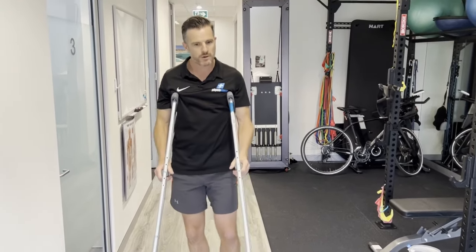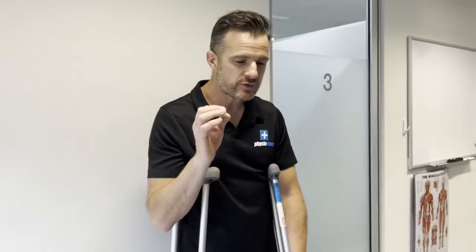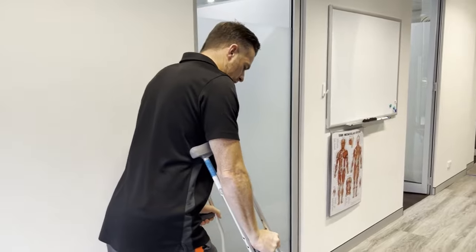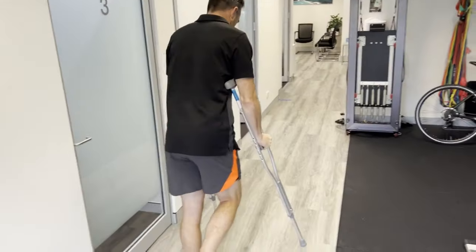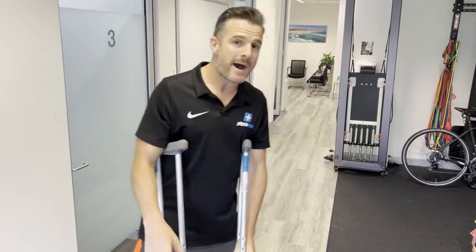When walking initially, if you've been instructed to be non-weight bearing, you're going to have one leg in the air: crutches forward and step, crutches forward and step. If you're partial weight bearing, there are a couple of things to keep in mind.